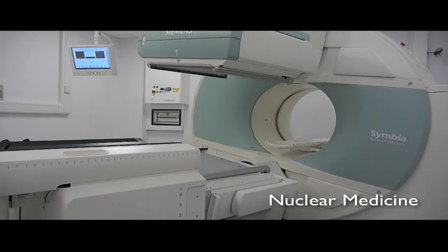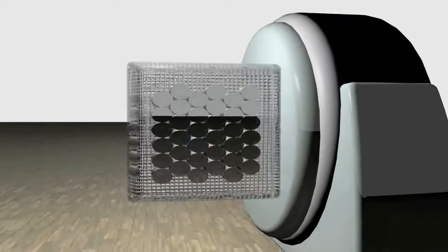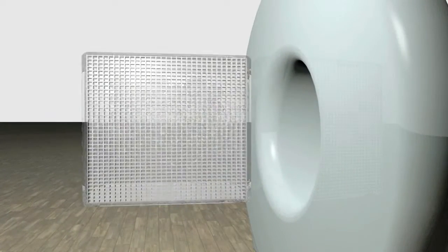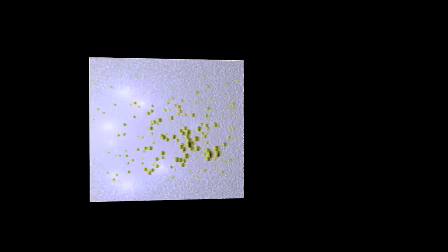So this is called a gamma camera. There are two cameras here. Let's strip away one of them. Let's focus in on the other one. And right at the heart of this camera is a very simple material. I've got a lump here. It's called sodium iodide. It's just like sodium chloride, the stuff you put on your fish and chips, except the chlorine's being replaced with iodine. So it's a pretty simple material. But the neat thing about this material is that when you shine x-rays on it, it gives off little flashes of light.